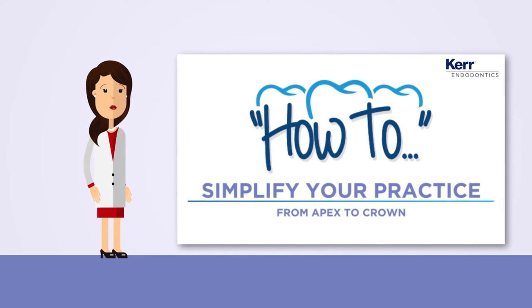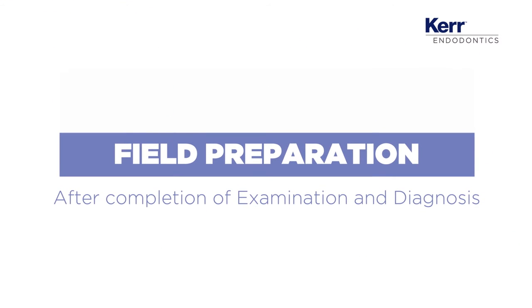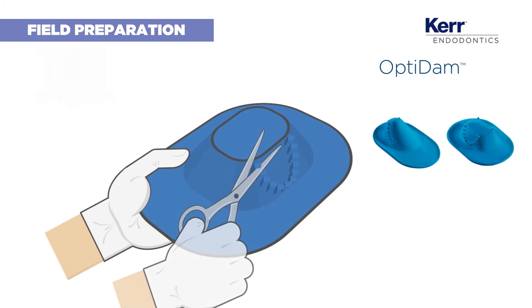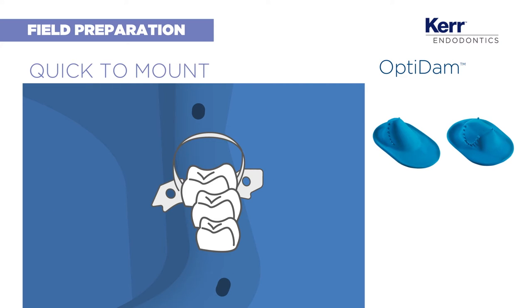Today we're going to look at an endodontic treatment requiring a complete tooth reconstruction. We are going to start by isolating the operative field with a rubber dam. OptiDAM is a 3D anatomical dam with a unique design that allows you to mount it quickly. Make sure that the tooth is completely isolated to avoid fluids running into the oral cavity.